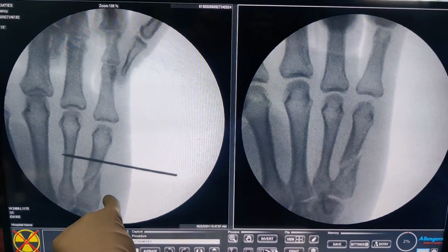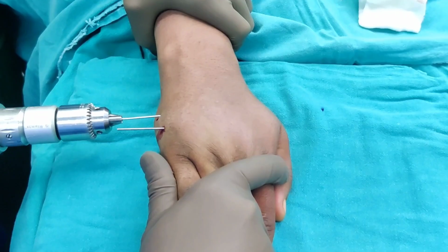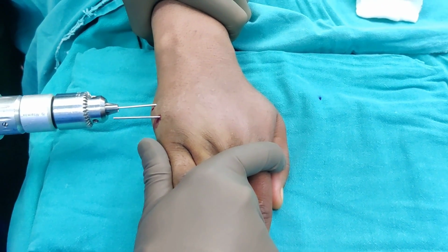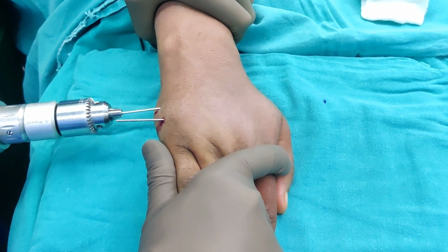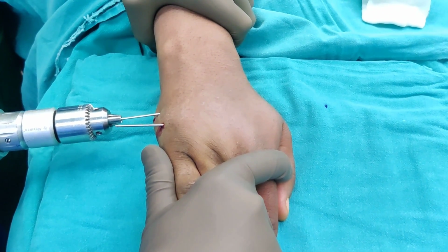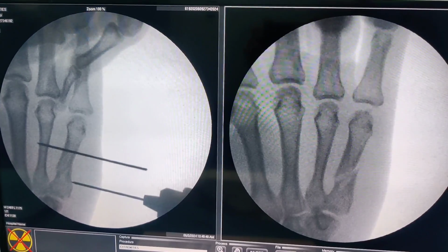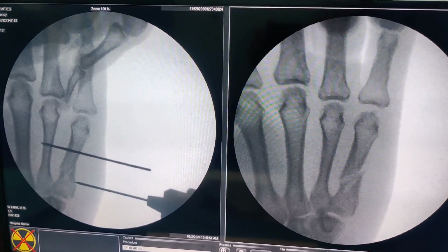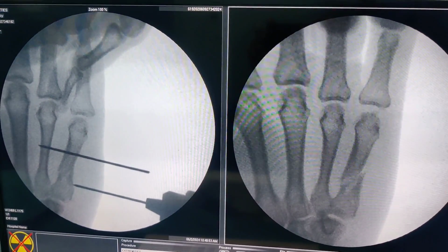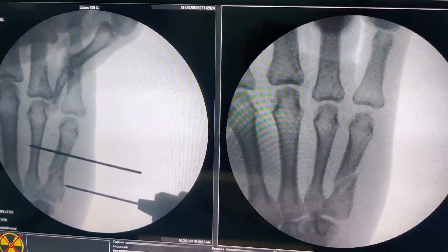Our next wire will be from here into the base, and this should be slightly easy. Whenever I am passing the wire with my right hand, I am giving the traction. Now I have located my entry point in the proximal fragment, and I will show you where it is in the C-arm. If you see that I am into the proximal fragment, you could be slightly proximal, but it doesn't really matter. All you want is the fracture to be nicely aligned.